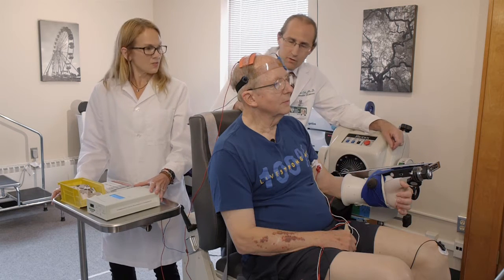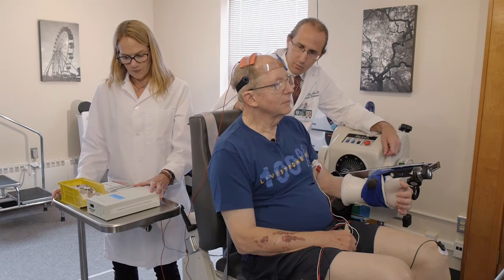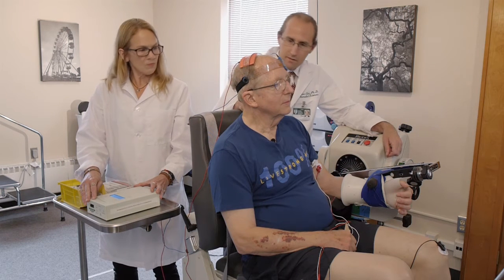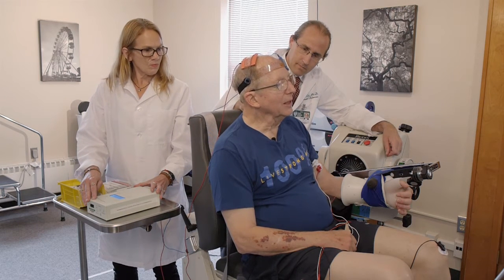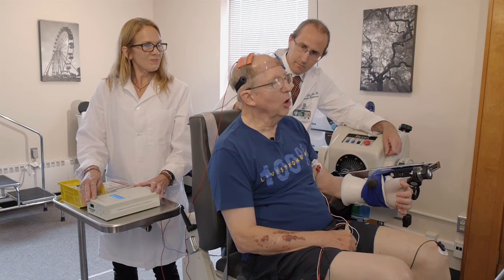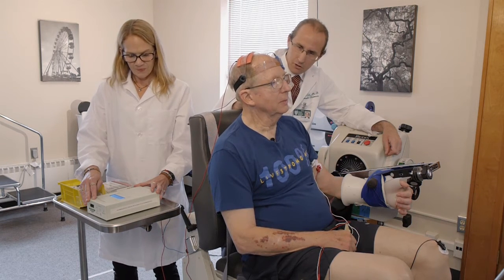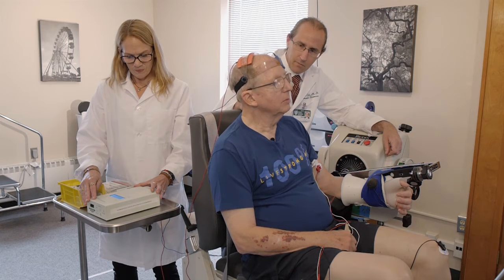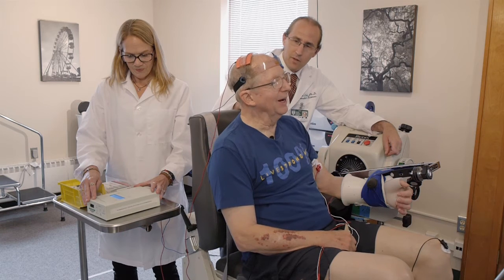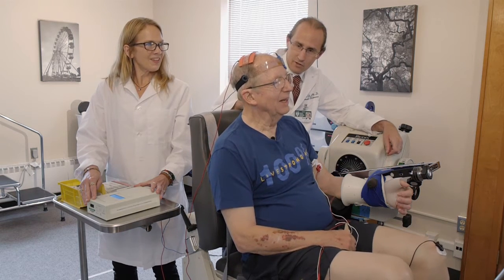We've started the stimulation. You may feel a little something. Are you feeling anything? It just feels like I'm sweating. There's no pain. Does it itch or scratch at all? No. I just feel like I should be wiping my brow — that may be the saline that these have been soaked in.